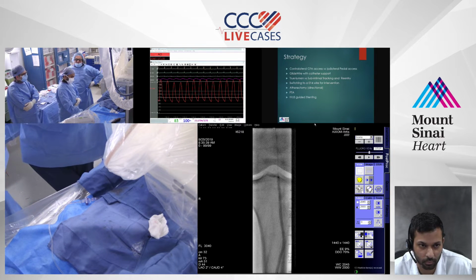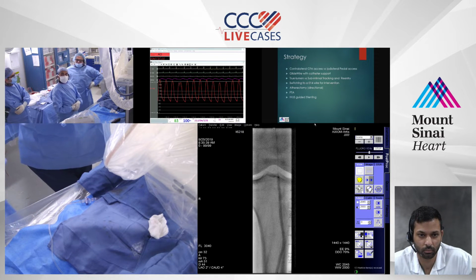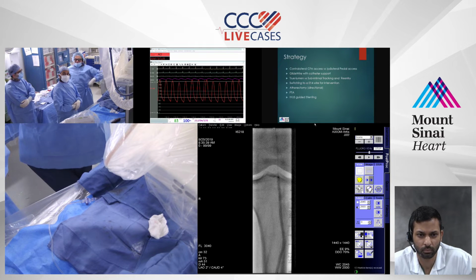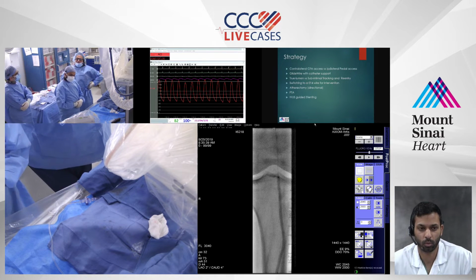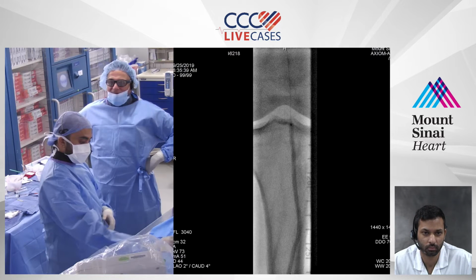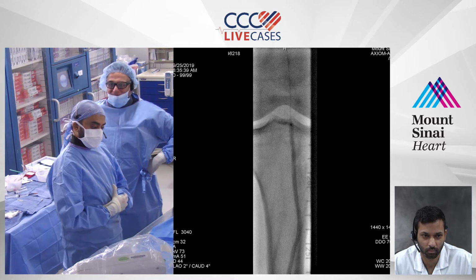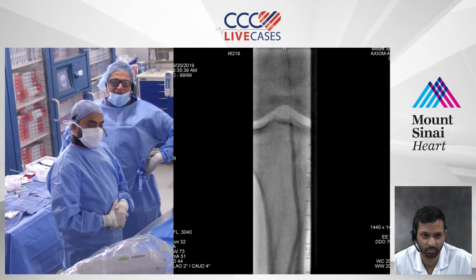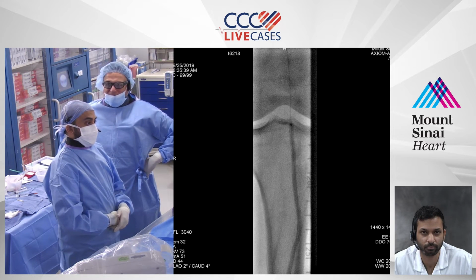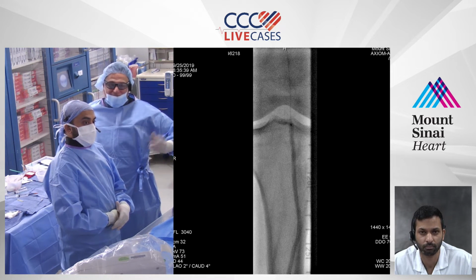That's great. We do about 2 to 4 minutes, depending on whether it's a CTO or not. Obviously, it's not a heart, so the leg can tolerate ischemia very well, and he is an ischemic leg. So at this stage, we're just going to leave it up for 3 to 4 minutes. It also depends on what our goal is. Ideally, I've consented this gentleman for drug-coated balloon technology. He's at a very high risk for restenosis. The FDA says in high-risk patients it may be a viable alternative to normal therapies. I've explained to him, and he told me, Doc, you do what you think is right for me, and I've said fine, and this is what I think is right.